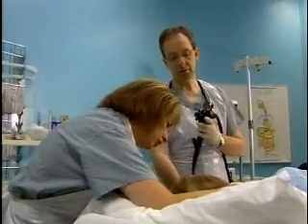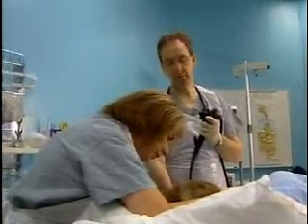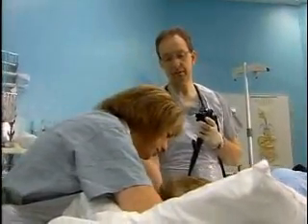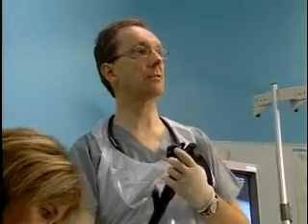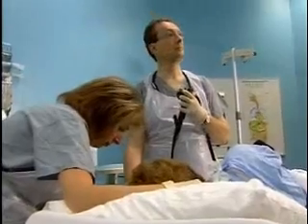In general, a gastroscopy will take somewhere about five to seven minutes. If a number of tissue samples or biopsies are being taken, the procedure may last a little longer, but it's rare for it to last more than ten minutes. For most patients, the most difficult time is right at the start as they're swallowing the tube for the first time. Once those first 30 to 60 seconds are over, patients become accustomed to the tube and can concentrate on taking shallow, slow breaths. Most patients say at the end that it was nothing like as bad as they had expected.